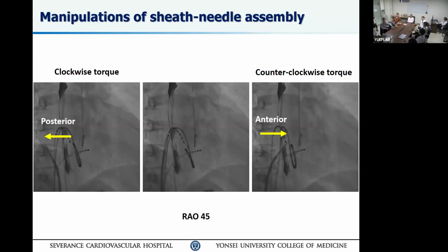Now, another question often asked by angioplasty or mitral valvuloplasty people: how should I puncture a mitral valve stenosis patient? If you have a high left atrial pressure, your left atrium is stretched like a football and bulging to the right, not the left. Normally it's the other way around. So then your needle needs to be straighter, because you're going to come up from the IVC, lateral, just going straight up. Otherwise, you need to keep buckling. You never get to the right spot, never engage the spot that you want, because your fossa ovalis no longer has that anatomic delineation. It's bulging like a balloon.